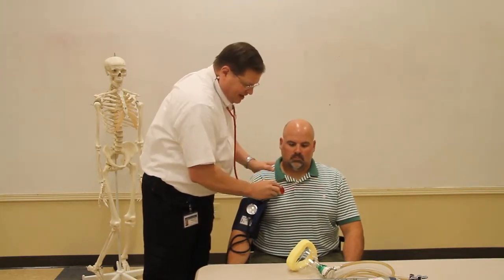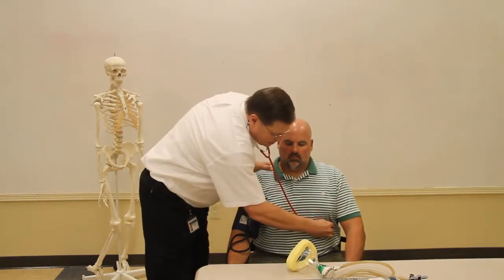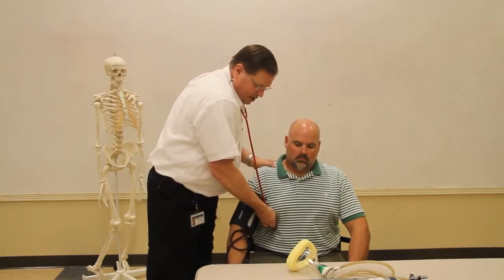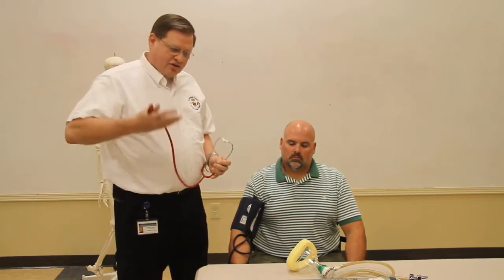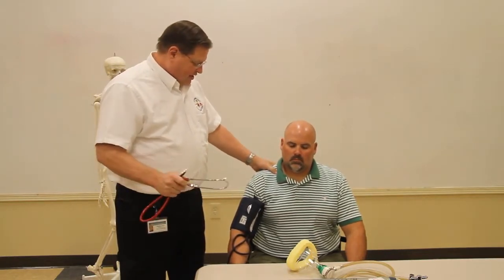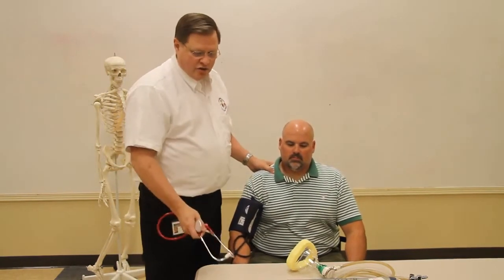We use a Z technique because we're comparing left to right, around to the side on the very lower lobes, and also right here. We're also checking for volume, making sure that he can breathe really well. So Lee, I want you to take a good deep breath. Very good. I'm looking for chest expansion also.